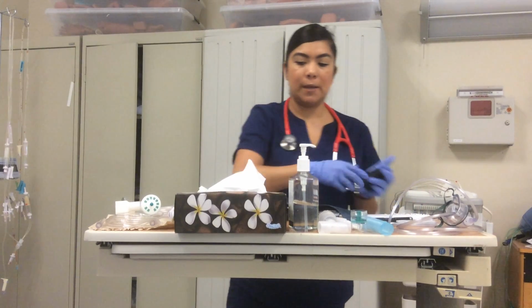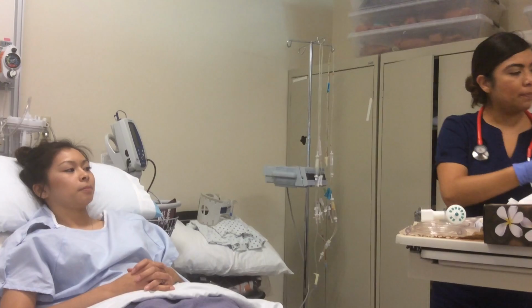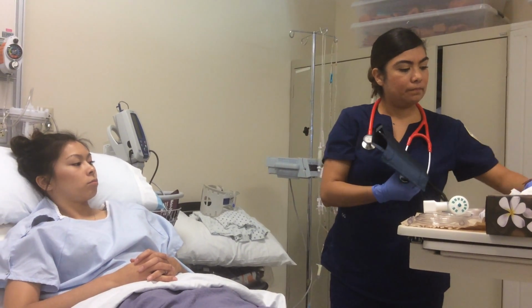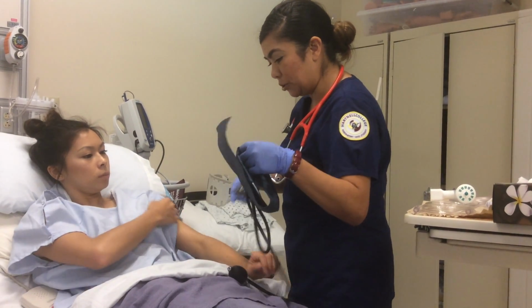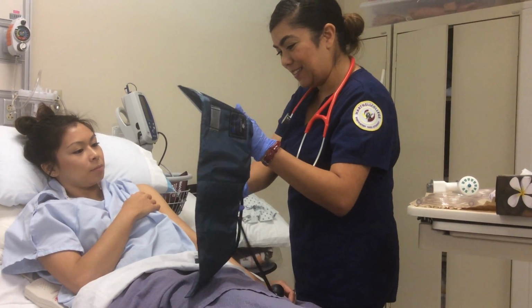And now I'm going to go ahead and obtain your blood pressure, okay? You may feel shaky, your heart rate increases, but that's normal for the medication, so nothing that's bad. This is just going to wrap around your arm. I'm sure you're probably used to this already, right? Yes. Okay.